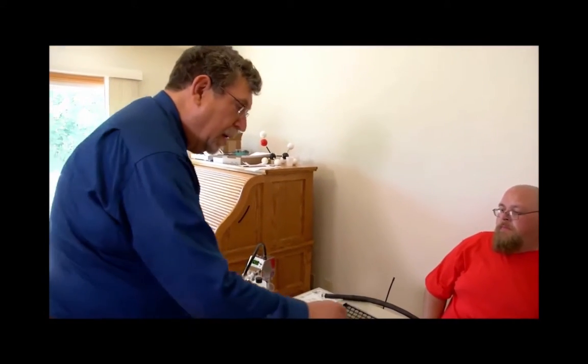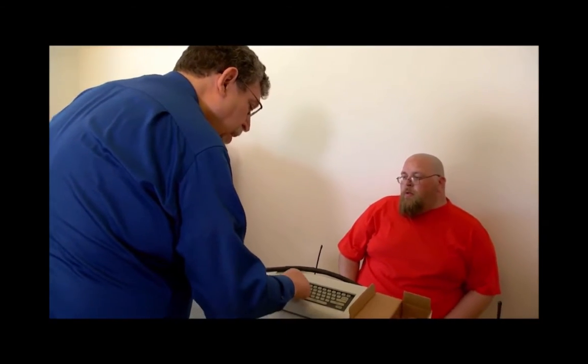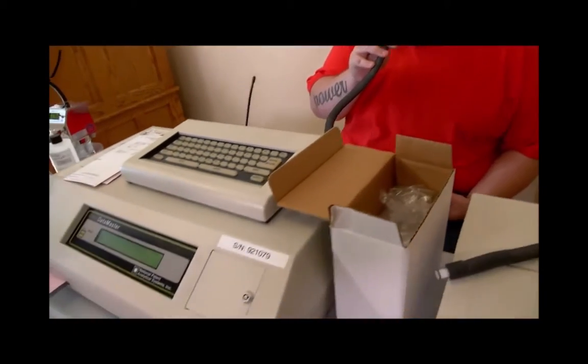Okay. I will now hit the run type operator. I'll blow a nice steady stream. And we'll go ahead and blow. Detect the overflow. Put it here. Stop.